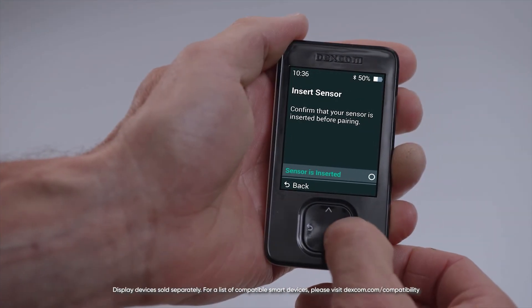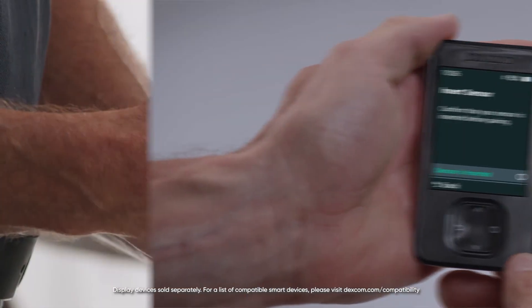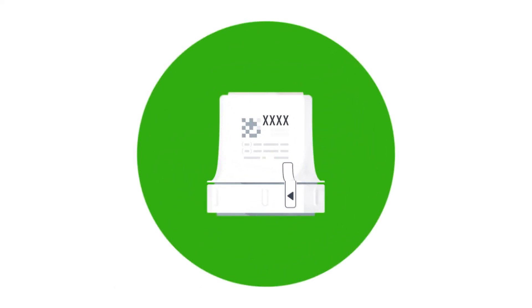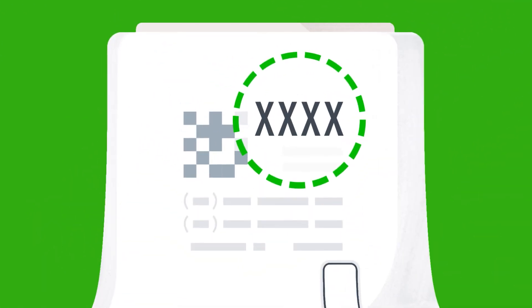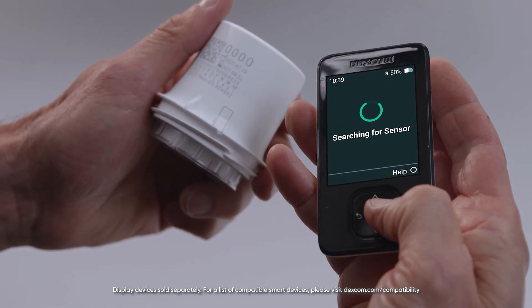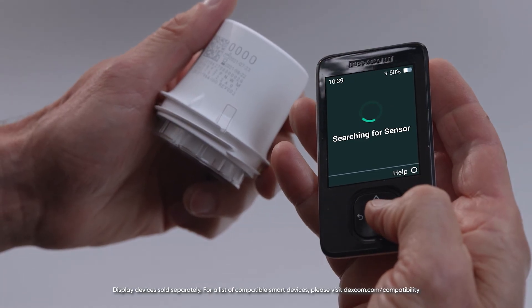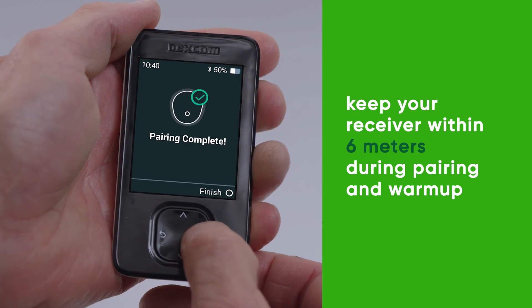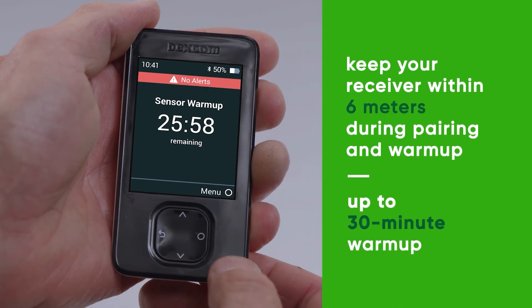Back on the receiver, select that your sensor is inserted. You will then need to enter the pairing code. You will find the four-digit pairing code on the applicator you used to insert the sensor. Wait for your sensor to pair. Once pairing is complete, select finish and you will enter into your sensor warm-up. The sensor warm-up timer lets you know when you'll start getting readings and alerts.